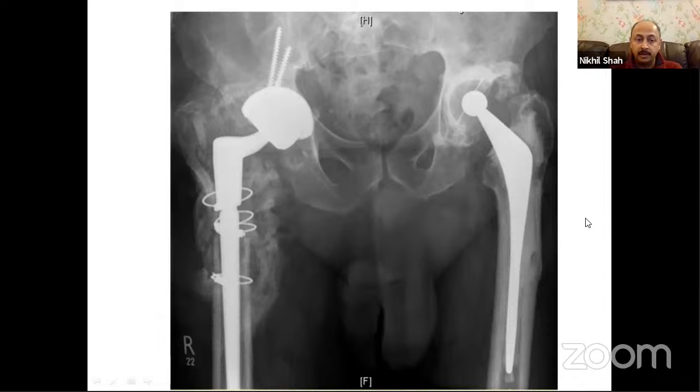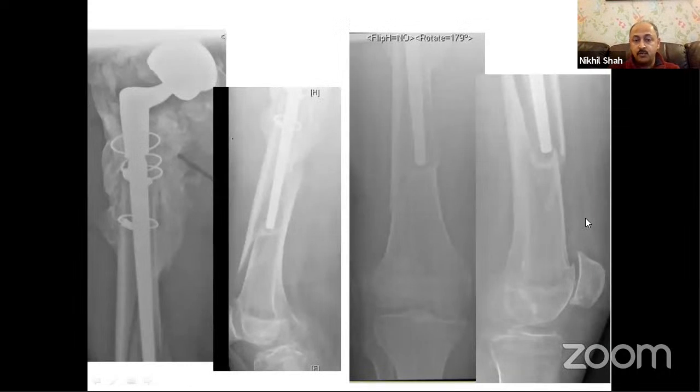Unfortunately, what happens is when you have a loose stem, it keeps toggling in the femur and the femur balloons out, and the next fracture happens at the tip of the stem. This was a non-traumatic fracture, which goes all the way to the proximal femur, and you've hardly got any distal femur left now. So you're in the territory where this is fairly extreme orthopedics. You have a lot of HO at the top. The exposure is going to be difficult.